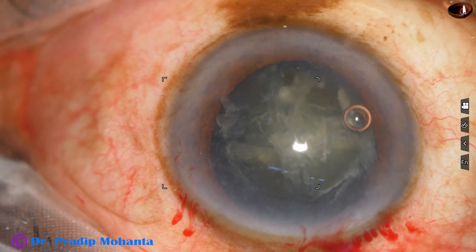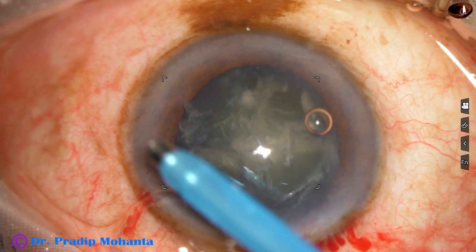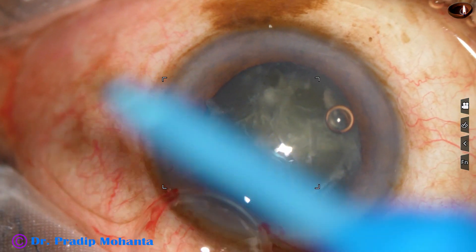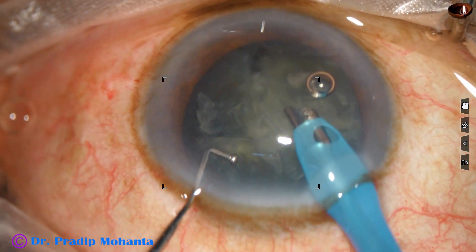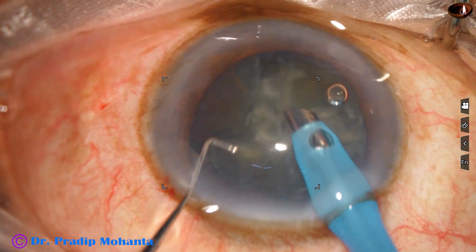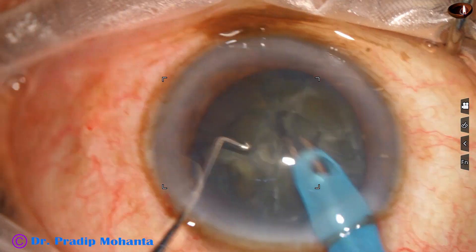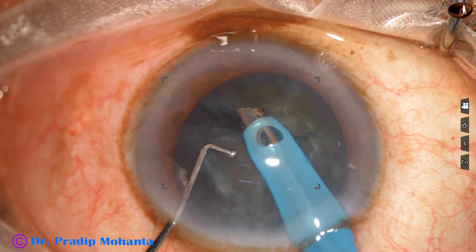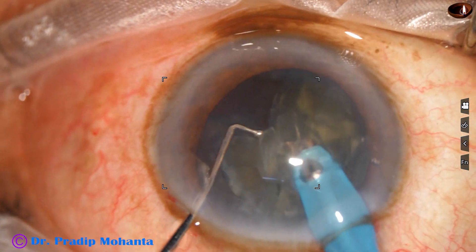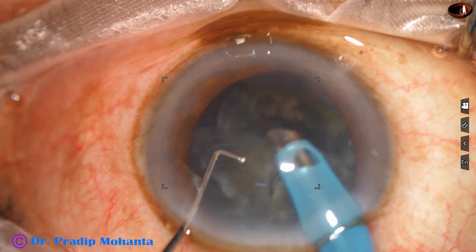Now we fill up the anterior chamber again with viscoelastic, and the handpiece is introduced. The left hand instrument during pre-chopping is called the sustainer — it is a chopper whose design is like the chopper used by Dr. Neto Rosatelli, so I call it a Neto chopper.